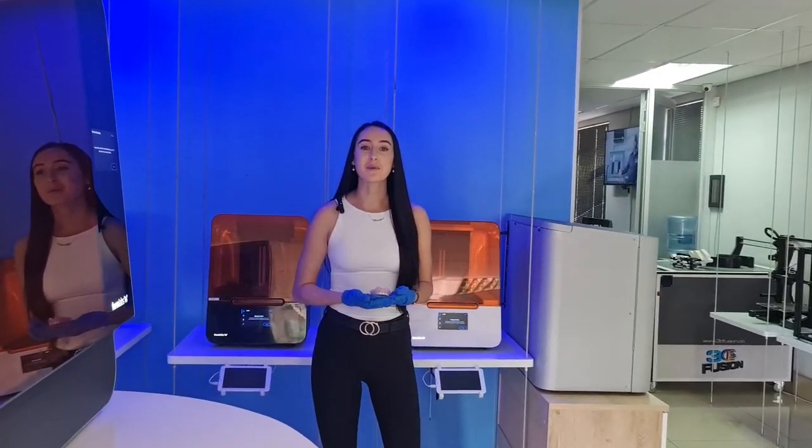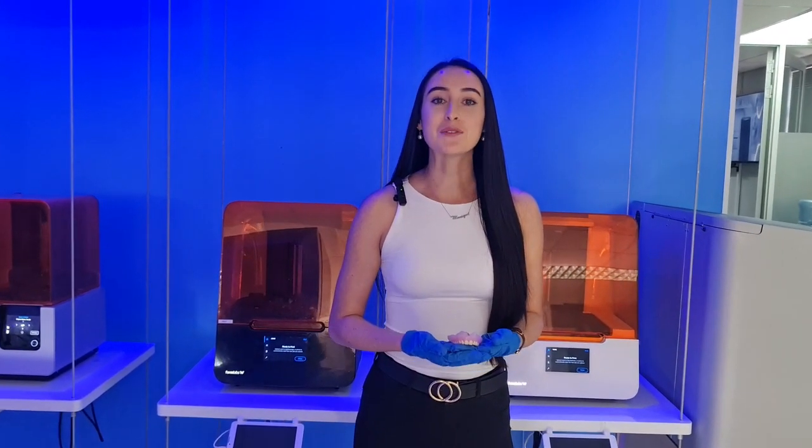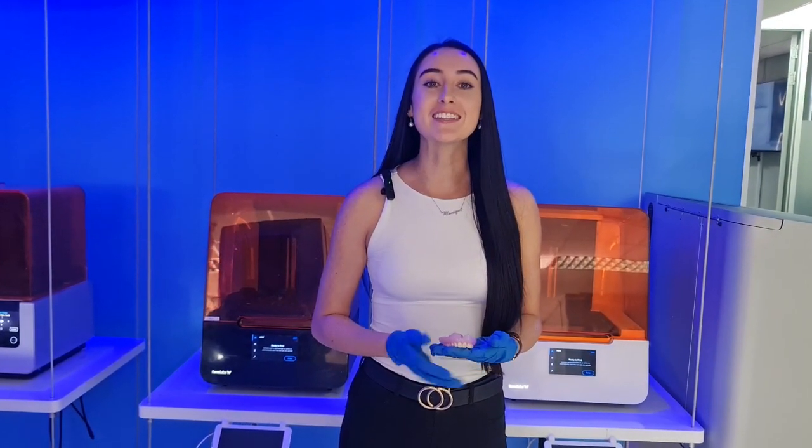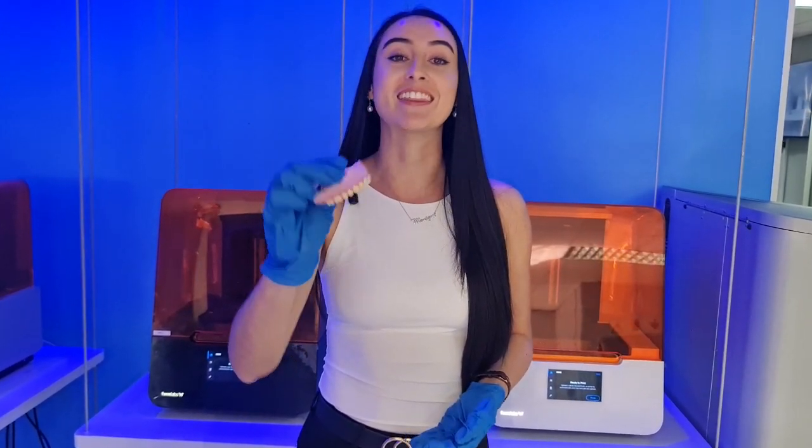3D printing is changing the way that dentists can create custom dental implants and prosthetics. With 3D printing, dentists can create dental implants and prosthetics that are more realistic and natural looking than ever before.